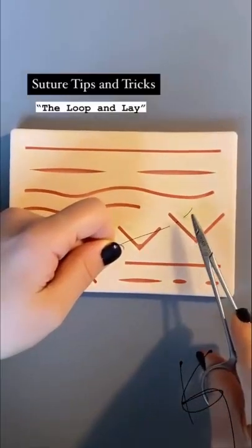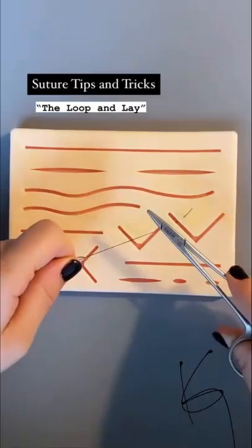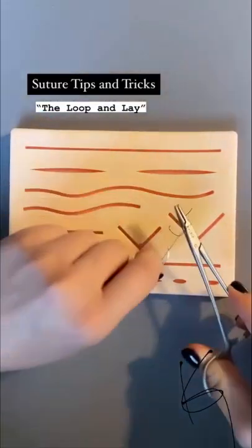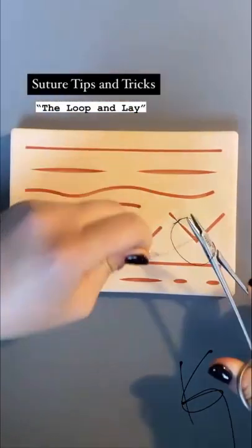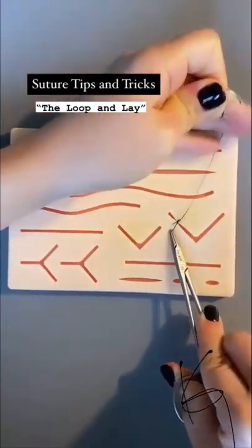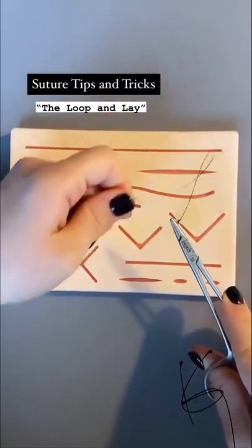Tutorial on how to tie your suture knots: once you have the appropriate length of the tail that you want to leave, you take the needle driver and with your left hand you do two loops around it, grab the suture tail, lay the needle down flat, loop around, lay it flat, loop around in the opposite direction, and lay it flat. You want the right hand to stay as still as possible and let the left do all the moving.